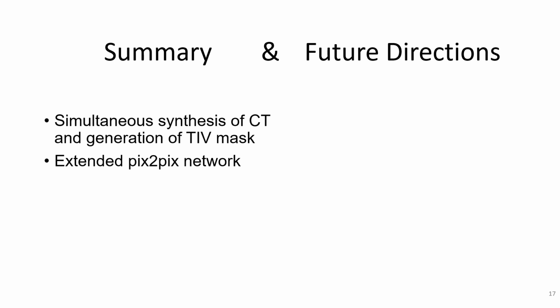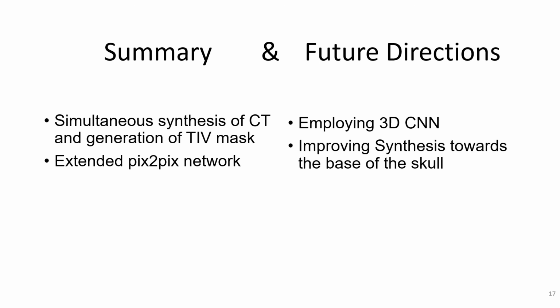Although our method showed some improvements over the existing method, we hope to bring about more improvement by employing a 3D CNN instead of a 2D CNN. We also find that synthesis towards the base of the skull seems to be lacking. Hence, we aim on improving the synthesis of the skull. Working with a different set of cohorts should help us also address the issues with domain shift.